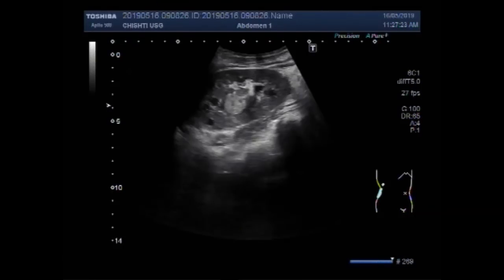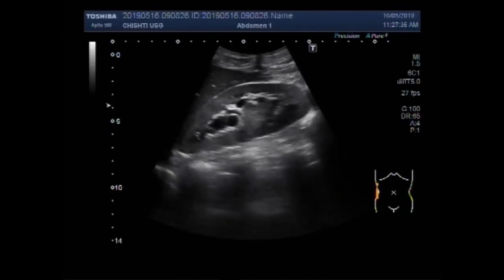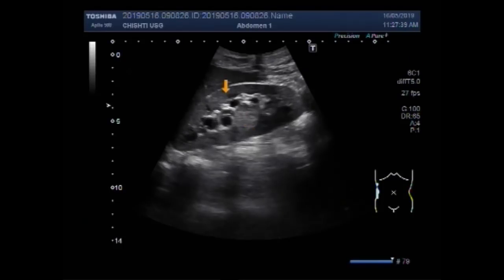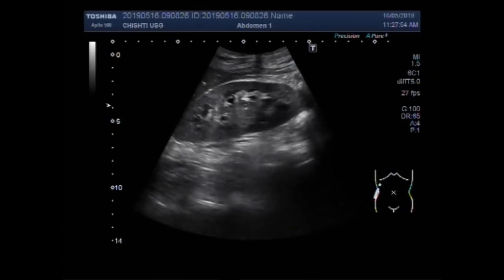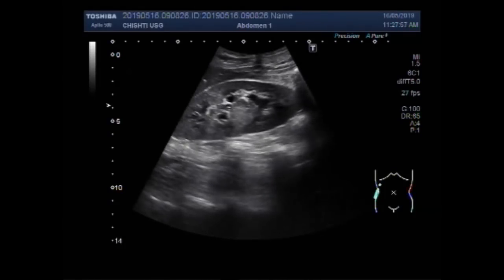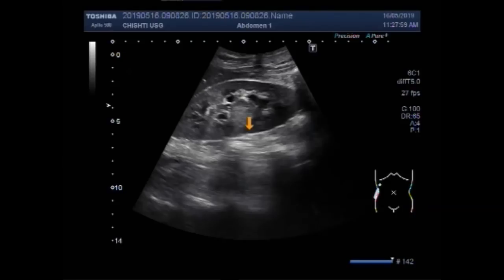Now you are going to see another video having a renal mass. The mass lies in the central portion of the right kidney, and this is the liver. This mass is also round to oval in shape but having homogeneous echogenicity. This is an angiomyolipoma.